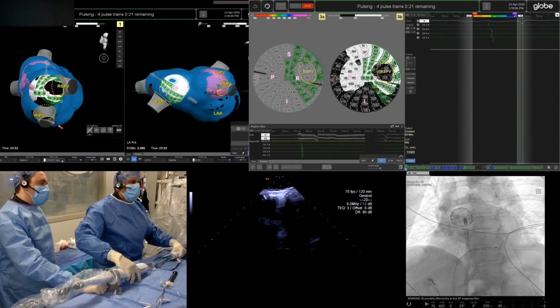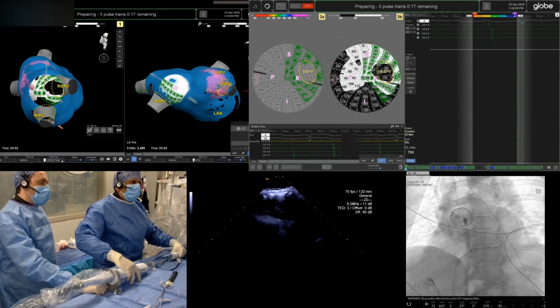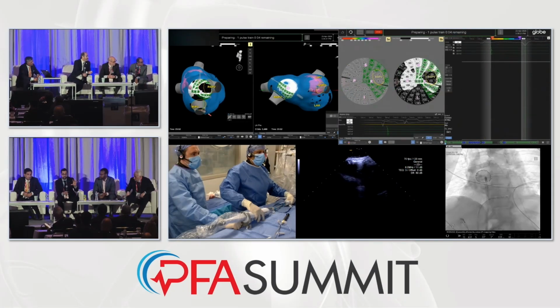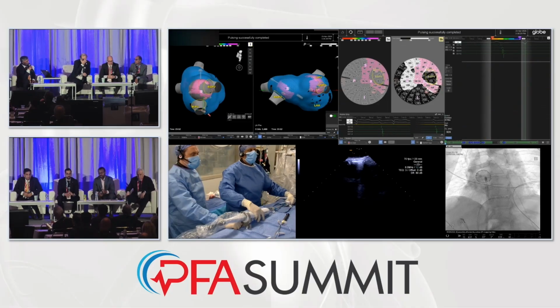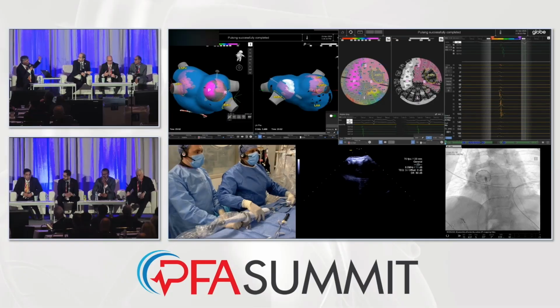And we have an abstract where we've done mitral isthmus ablation as well as CT isthmus ablation. So it looks like here, compared to some of the single shot technologies, you don't necessarily have to be perfectly aligned. You can be kind of canted into it, and as long as you've got contact around the right. So it is, and that's one of the nice things. It's directionally independent, right?